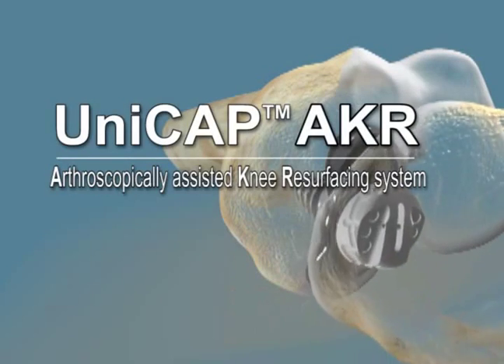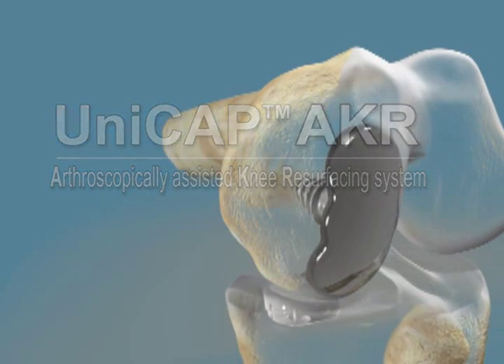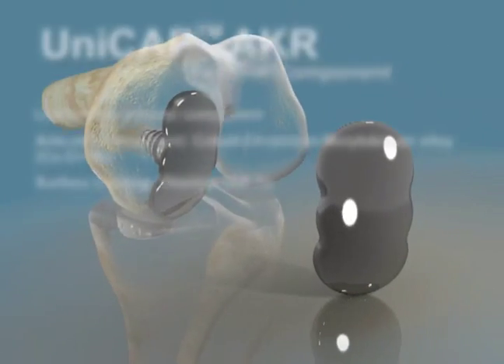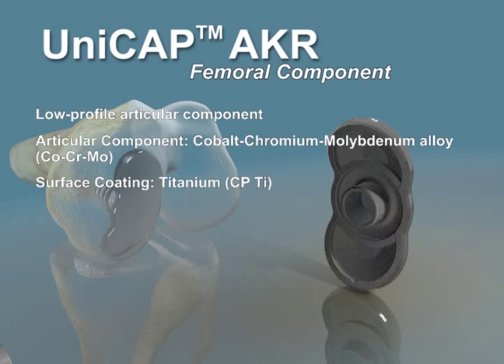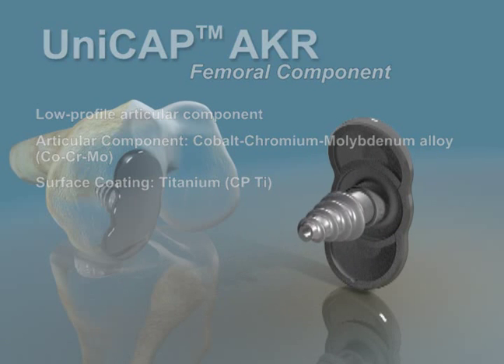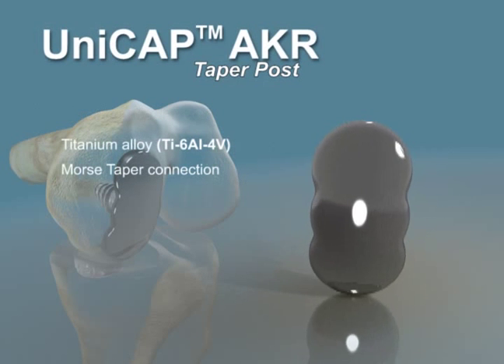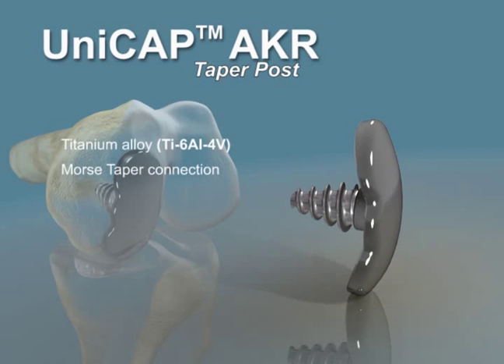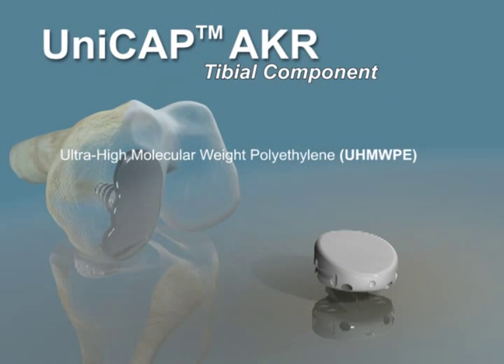The Unicap AKR knee resurfacing system from Arthrosurface is comprised of two components. The femoral component is a cobalt chrome articular bearing surface with a titanium taper post that is connected via Morse taper. The cemented tibial component is an ultra-high molecular weight polyethylene with interdigitations on the bottom for cement fixation.